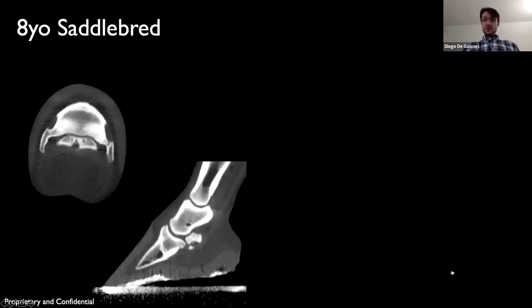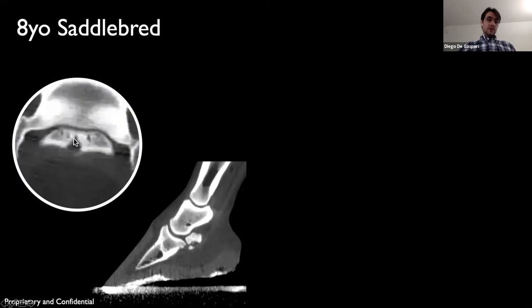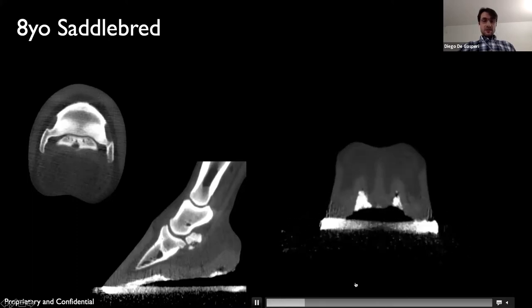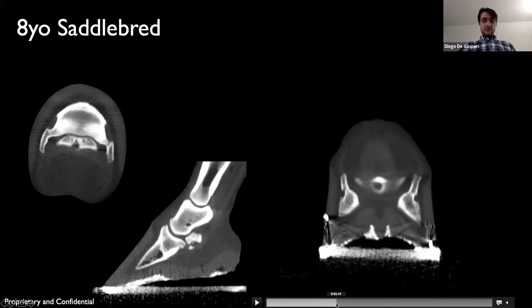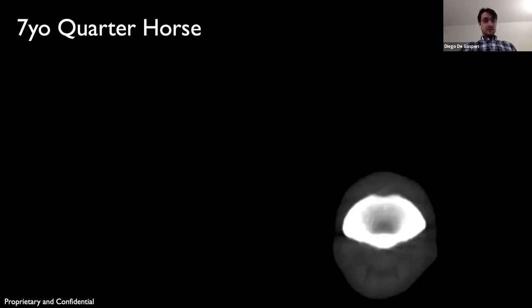These are still images of CT that revealed a large flexor cortical erosion that communicates with the synovial invagination, as you can see in those two views. And on the video, I'm gonna pause so you can see in a different projection. That's the large cortex defect. And that shows some sclerosis and deeply penetrating synovial invaginations.